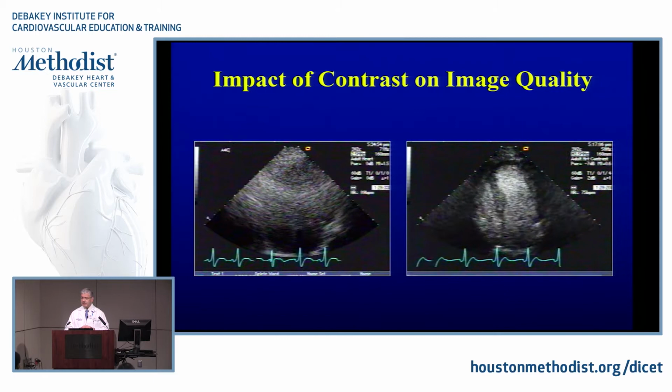appropriate indications, the appropriate indication for contrast now is non-visualization of the myocardium in two or more segments. I think that has panned out: your interpretation of ventricular function and wall motion goes downhill the more visualization is absent. Two or more, three, just imagine what happens if you have half of the heart not seen, right? So that's the appropriate indication for them.